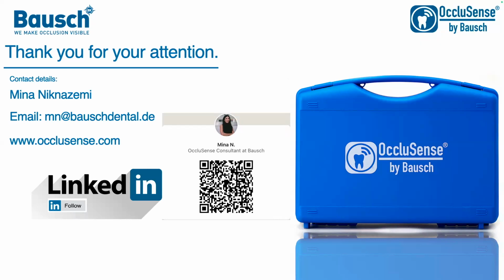Okay, thank you. I think that answers most of my questions. And you said the sensor along with the color paper, the size is about 60 microns, right? Yes. Okay, so that's very good.